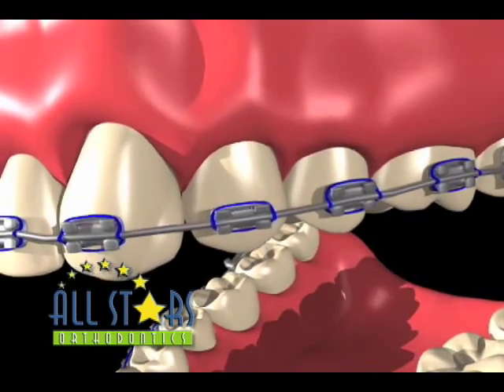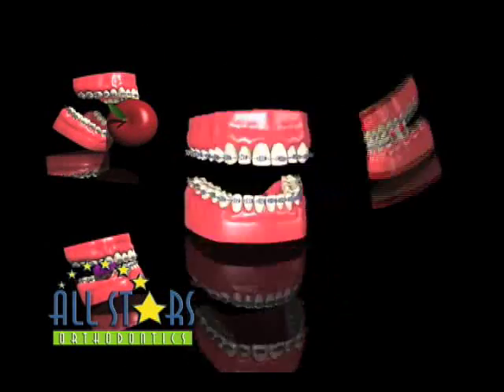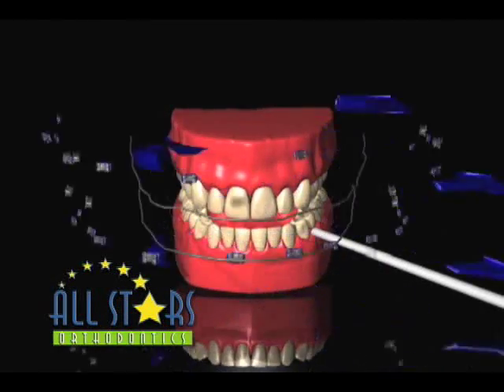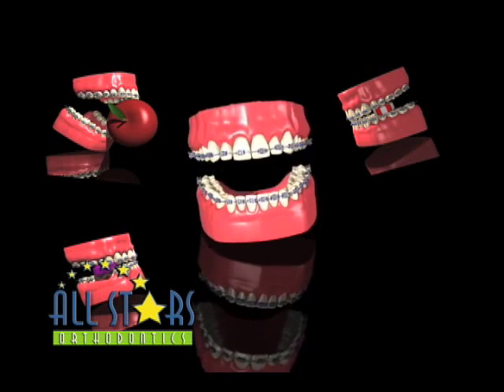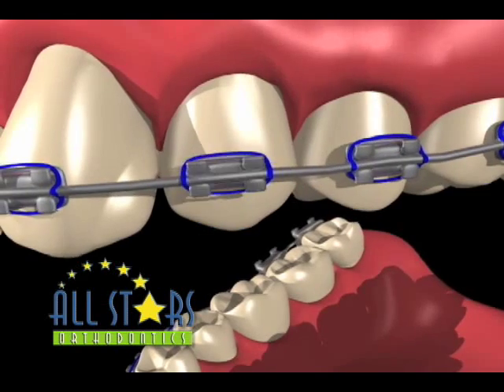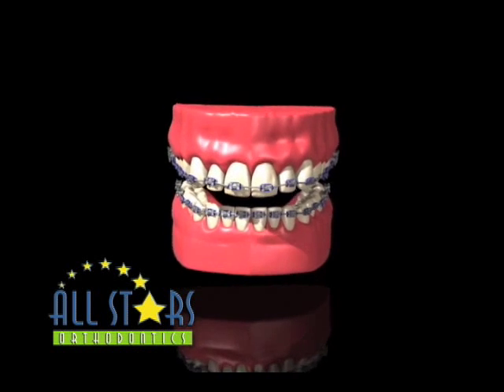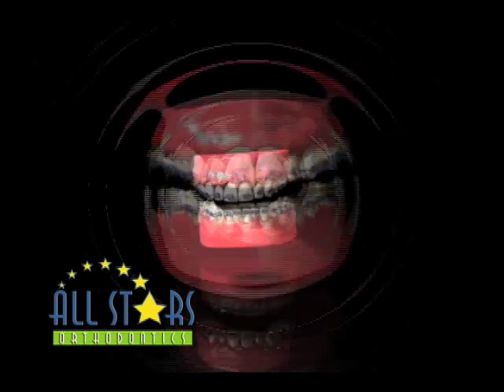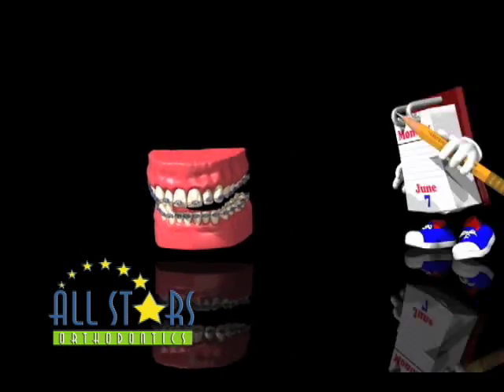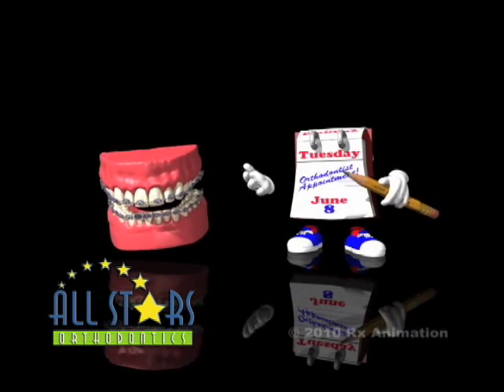Sometimes a brace may come loose from your tooth for any number of reasons. As long as the wire's not poking you, you don't have to consider this an orthodontic emergency. The brace remains attached to your wire by way of the colored tie or tying wire. Although this brace may feel different than your other braces, it's not doing any harm to your teeth. The doctor will evaluate this tooth at your next scheduled appointment to determine whether or not you need to replace the loose brace.